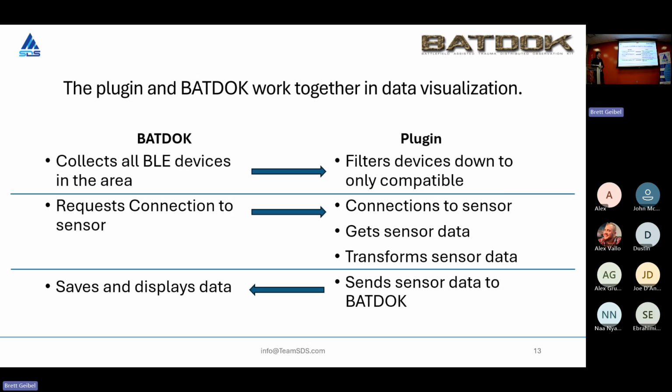That's really what BATDOK is trying to do here: help save lives, and I think that's a really great thing. And this is how plugins and BATDOK can work together to accomplish that.